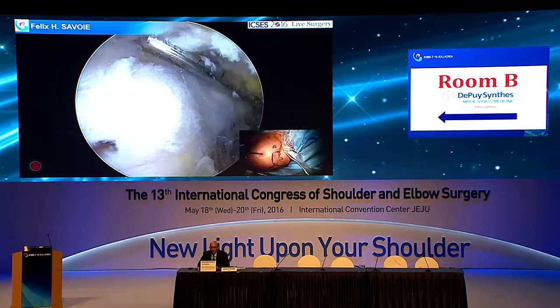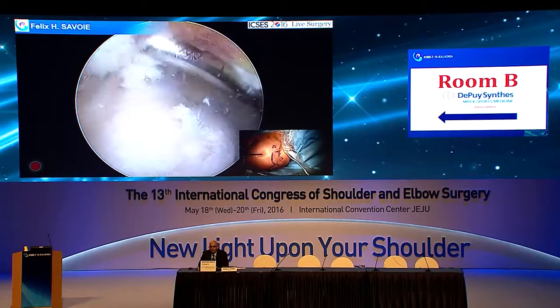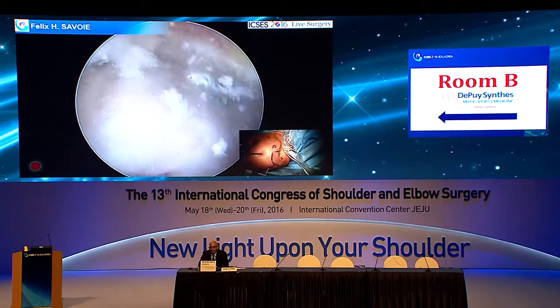We do want to clean up a little bit over here at the medial side of the acromion. And then here's where our CA ligament is. We haven't actually cauterized it yet. We'll do a little bit more there in a minute.